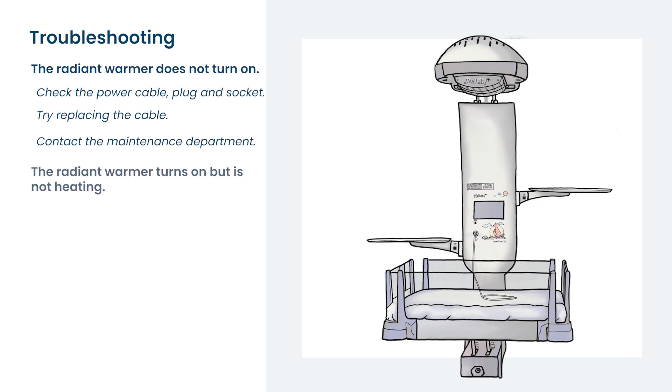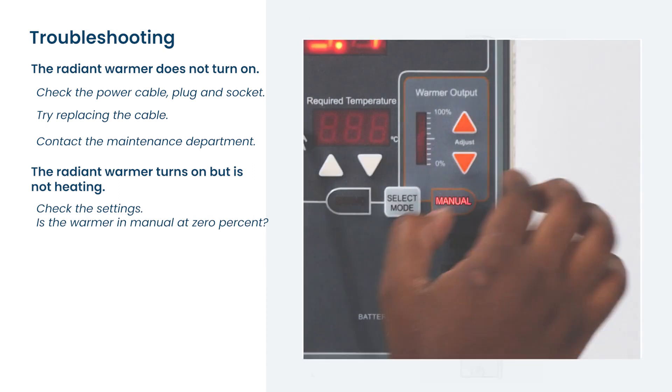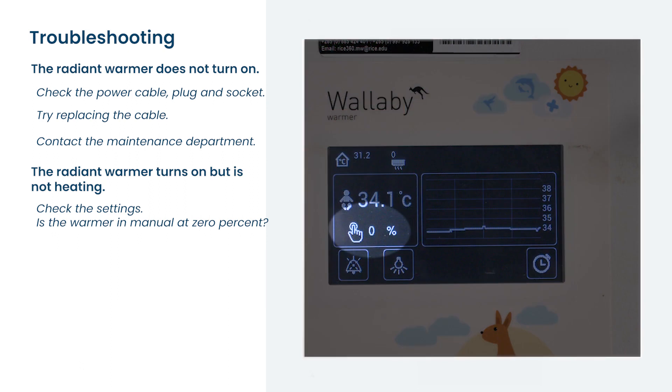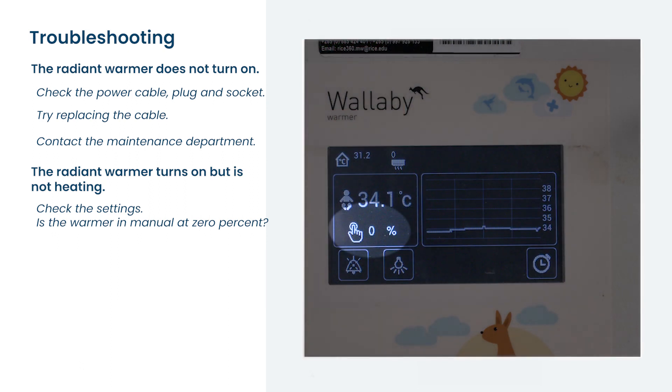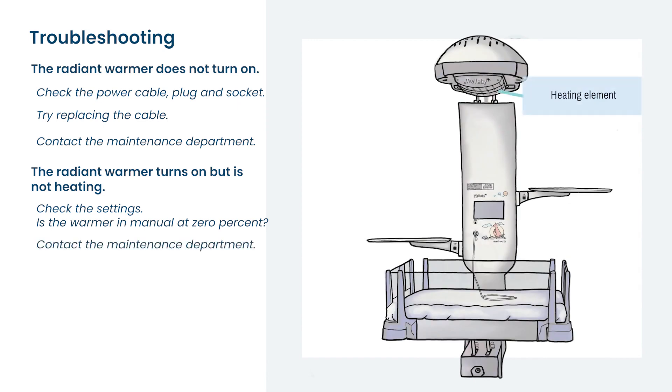If the radiant warmer turns on but you are getting no heat from the heating elements at the top of the machine, first of all check the settings. Make sure that you are not in manual with the output set at 0%. If the settings are correct, then it might be there is a problem with the heating elements. Contact your maintenance department.